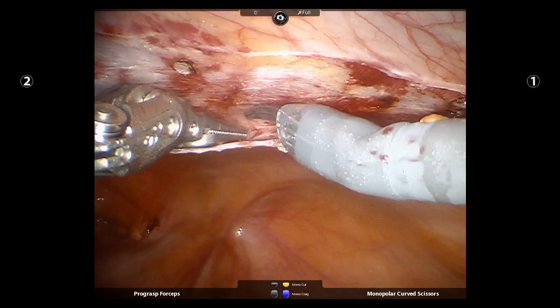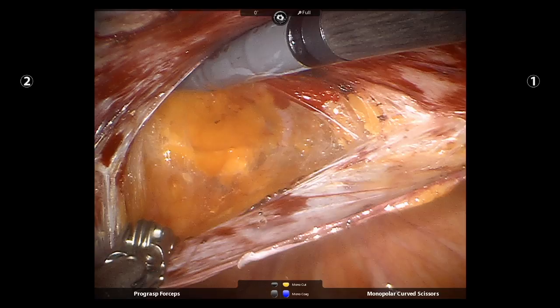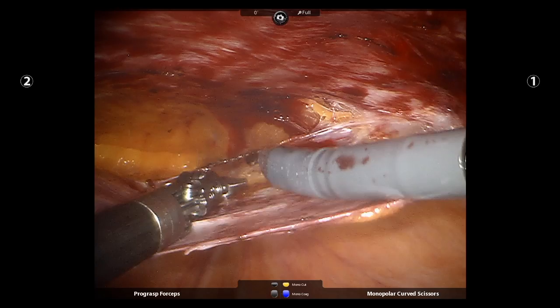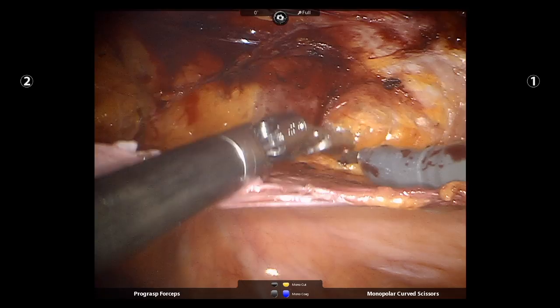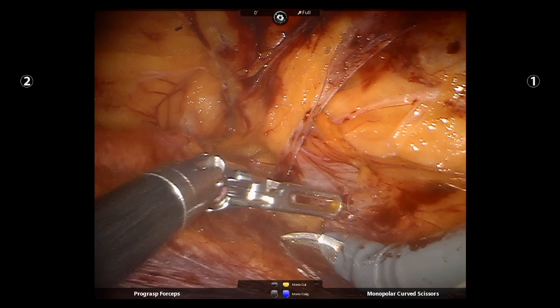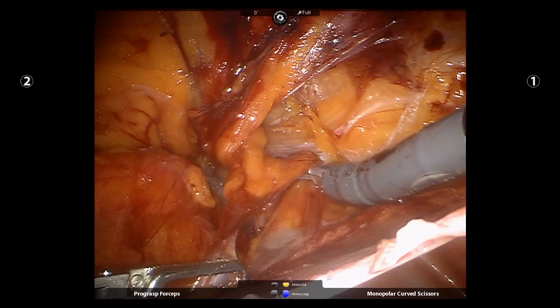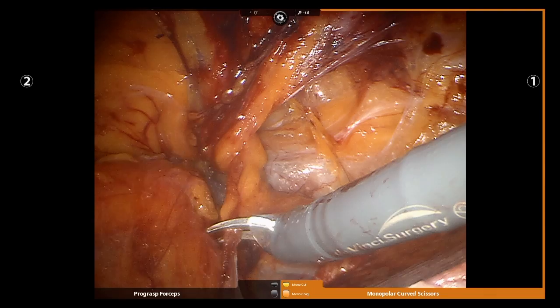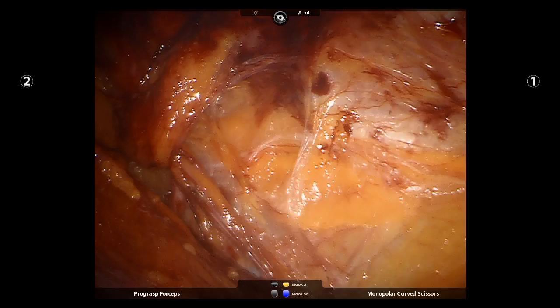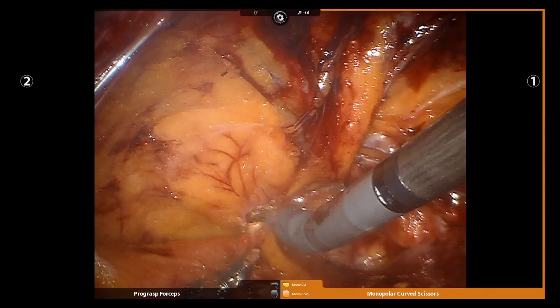With clear visualization of the epigastric vessels, it is clear that I am not yet in the true preperitoneal space. Here is an image of the incarcerated femoral hernia. I dissect on each side of the sac to better delineate the incarceration. It is clear that the sac did not reduce easily.